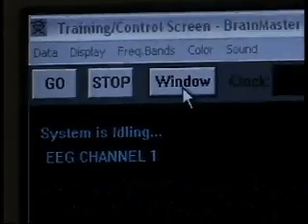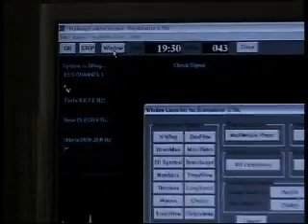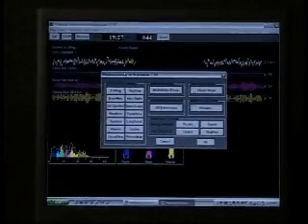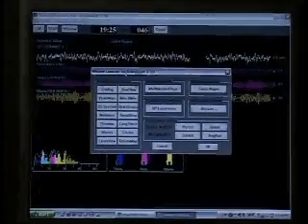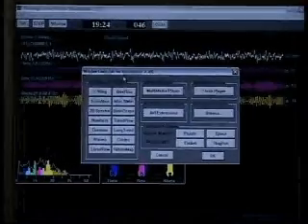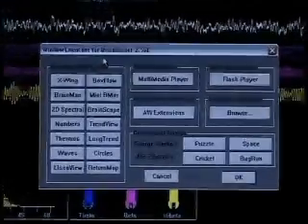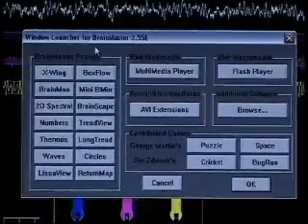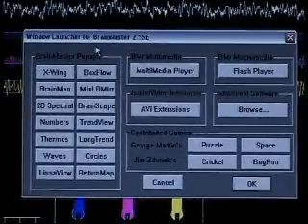So if we hit window, we get a window launcher for Brain Master 2.55E. And as we zoom in, we'll see a lot of different options here. These are different gaming options. For instance, I'm going to start with some of the basics.